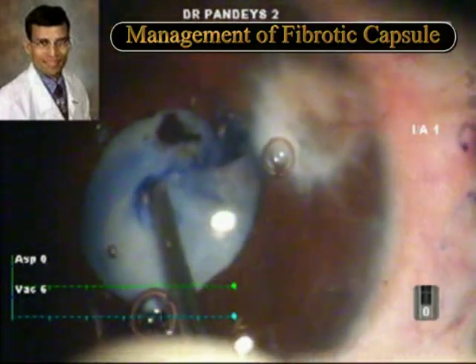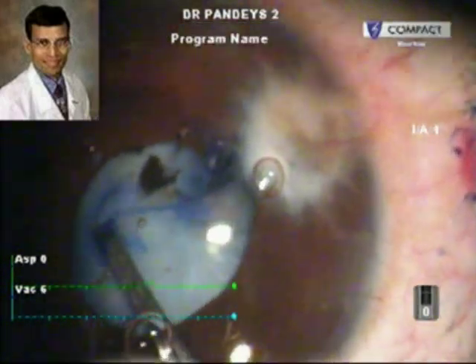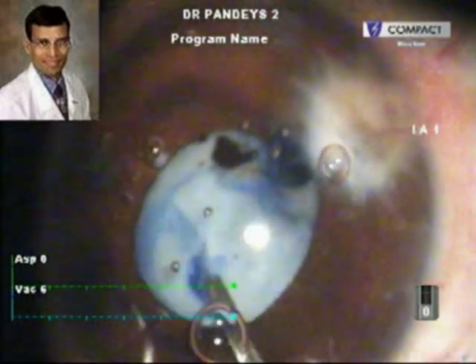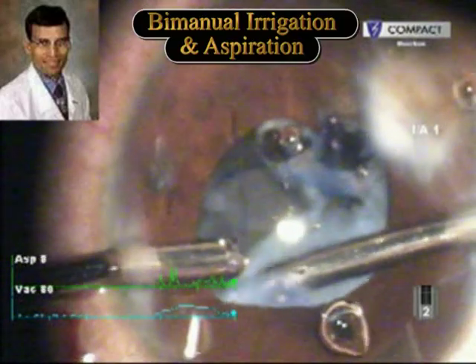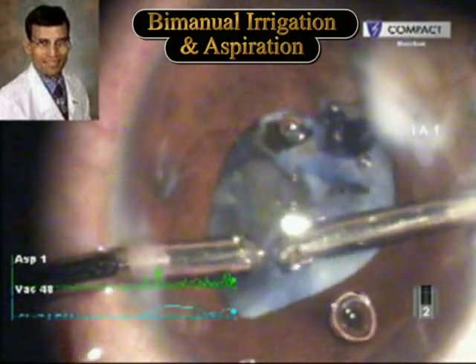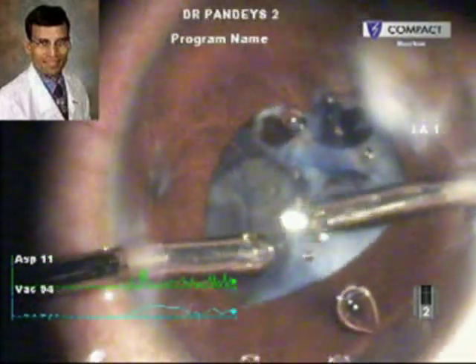Even though it was difficult, the capsulotomy could be completed. It wasn't a continuous rhexis, but the rhexis still achieved its purpose. Here, the cataract is being removed using bimanual irrigation aspiration.